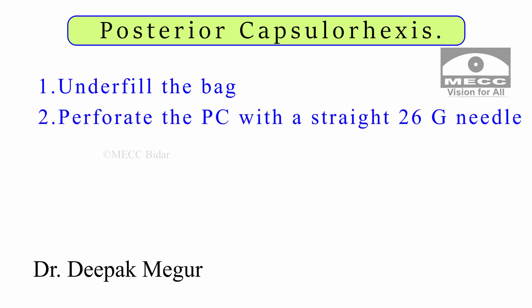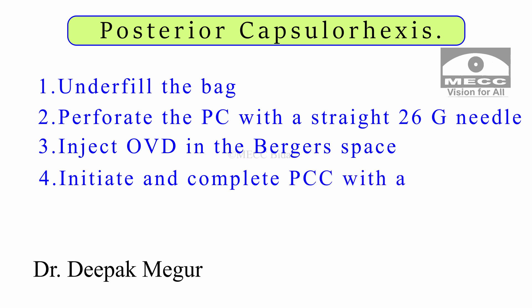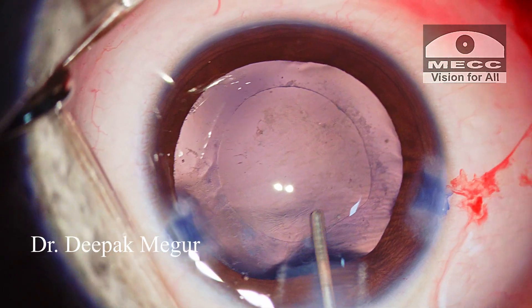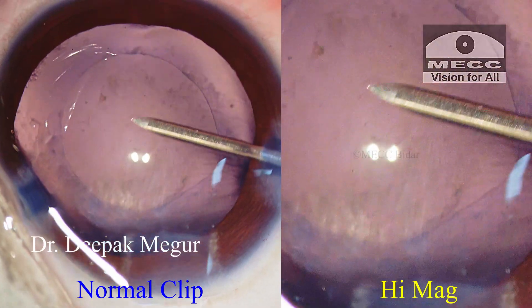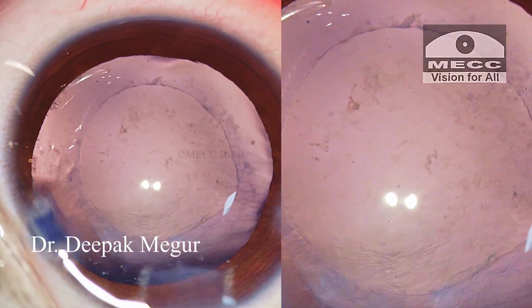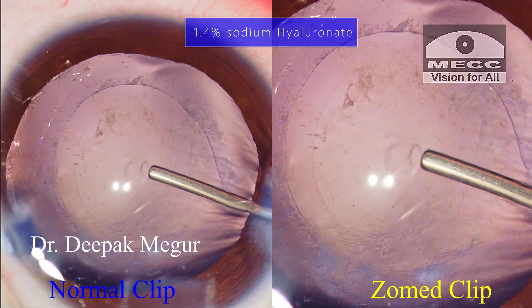A straight 26g needle is used to perforate the posterior capsule. After the posterior capsule opening is done, sodium hyaluronate is introduced through the opening into the Berger's space. And finally, the posterior capsule rhexis is completed using forceps through the side port. I begin by underfilling the bag with OVD. The capsule is perforated with the 26g straight needle, and through this opening, a little amount of sodium hyaluronate is introduced into the Berger's space.